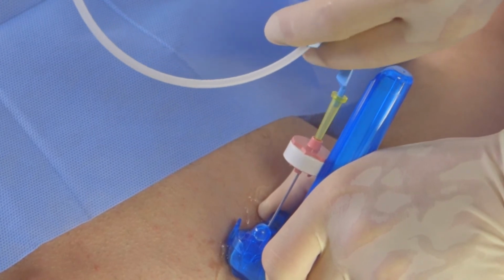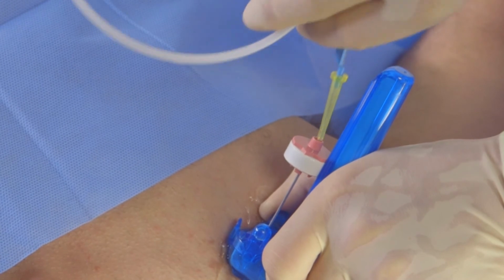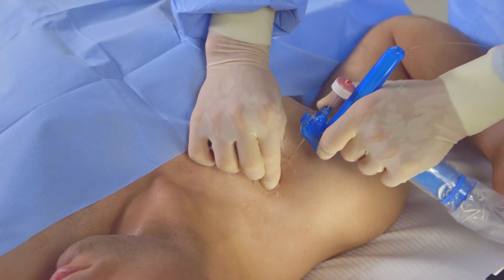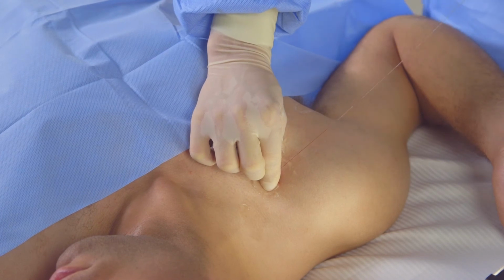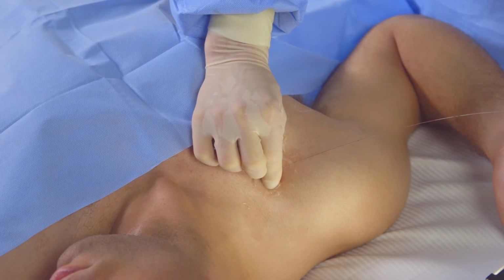The guide wire entering the vein can often be observed in real time on the sonogram. While maintaining gentle pressure on the needle clamp, withdraw the probe and needle over the guide wire, gripping the guide wire between the thumb and first or second finger once the needle tip clears the skin surface. Continue with the Seldinger technique.